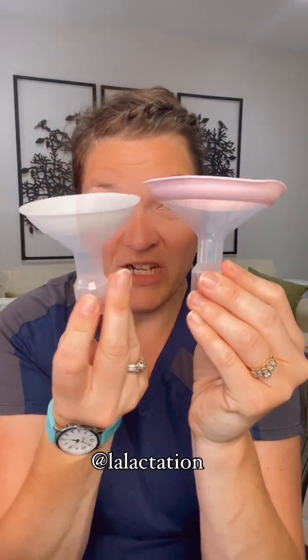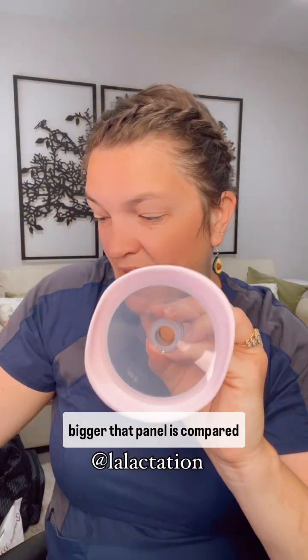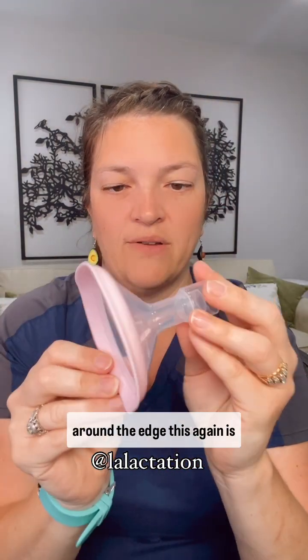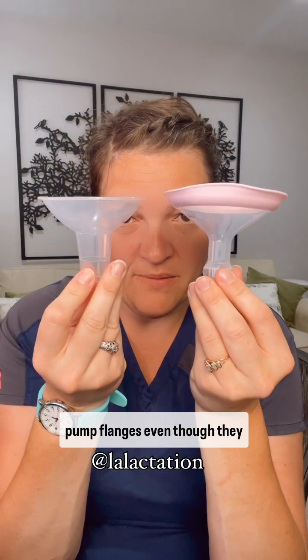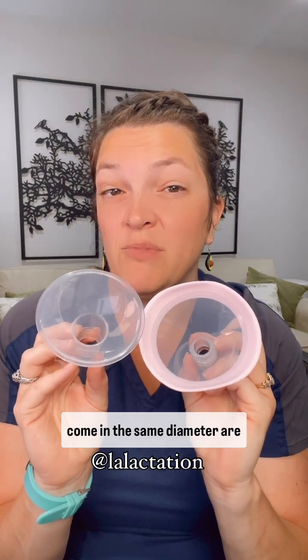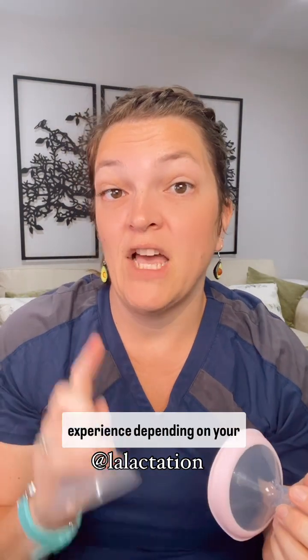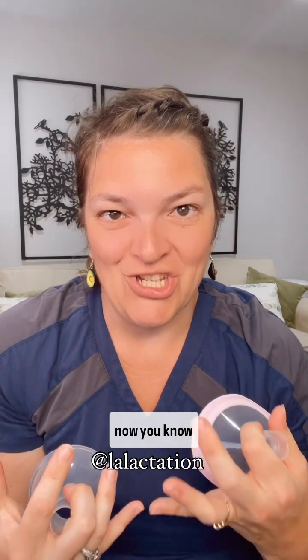This one is called the Pano. You can see how much bigger the Pano is compared to your regular flanges, and it has this soft silicone around the edge. This is better for a larger, wider breast, or maybe a doughier, softer breast. All of these pump flanges, even though they come in the same diameter, are going to give you a completely different pump experience depending on your breast size, shape, and tissue. Now you know.